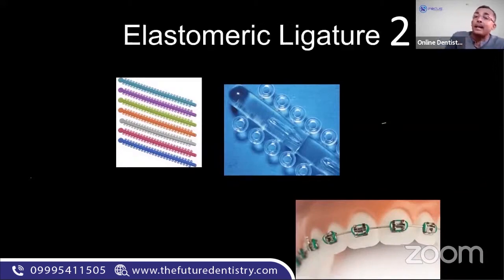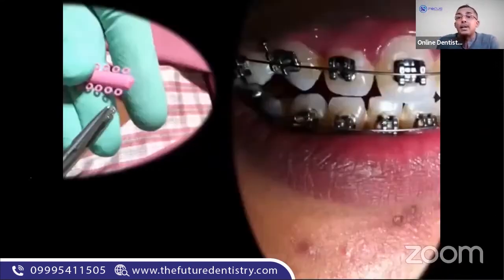The correct terminology for that is elastomeric ligature. Ligature wire is like 0.010 thin wire used to tie the archwire to the bracket. We are talking about elastomeric ligature. So this is the elastomeric ligature. That is the Matthews plier, and you take it with this and put it into this.